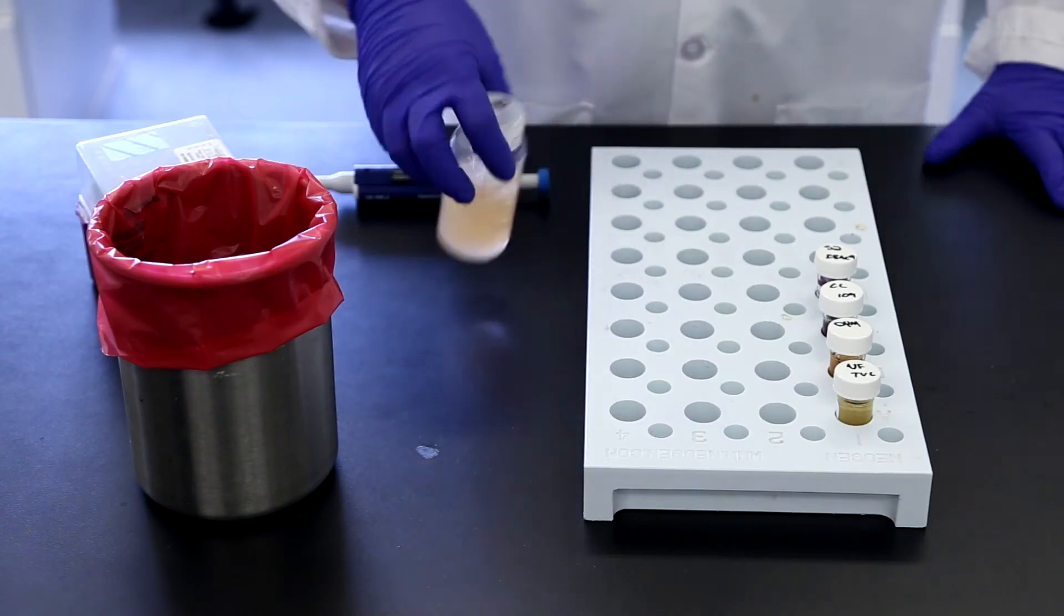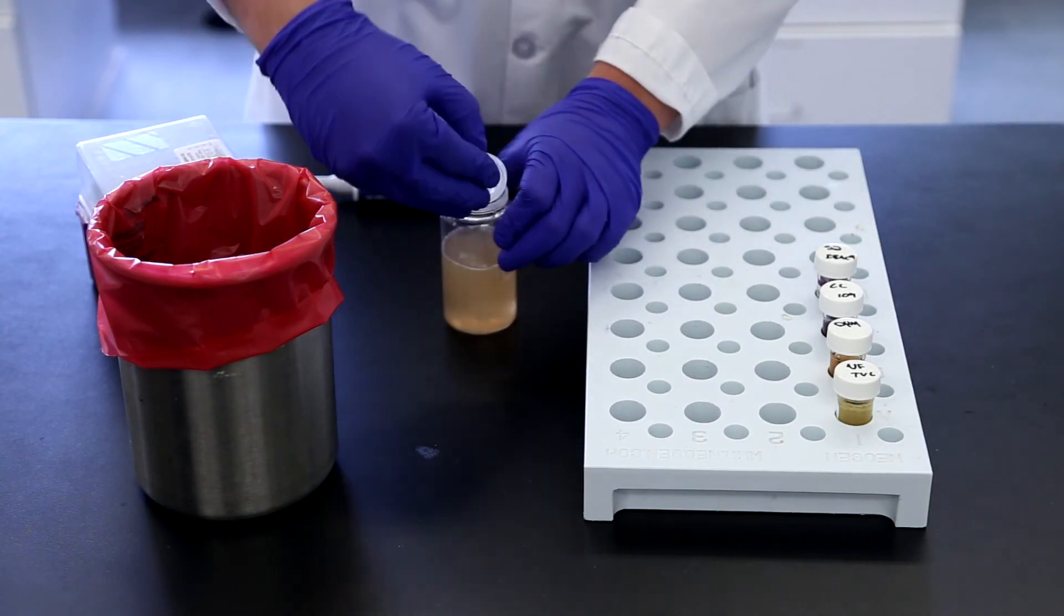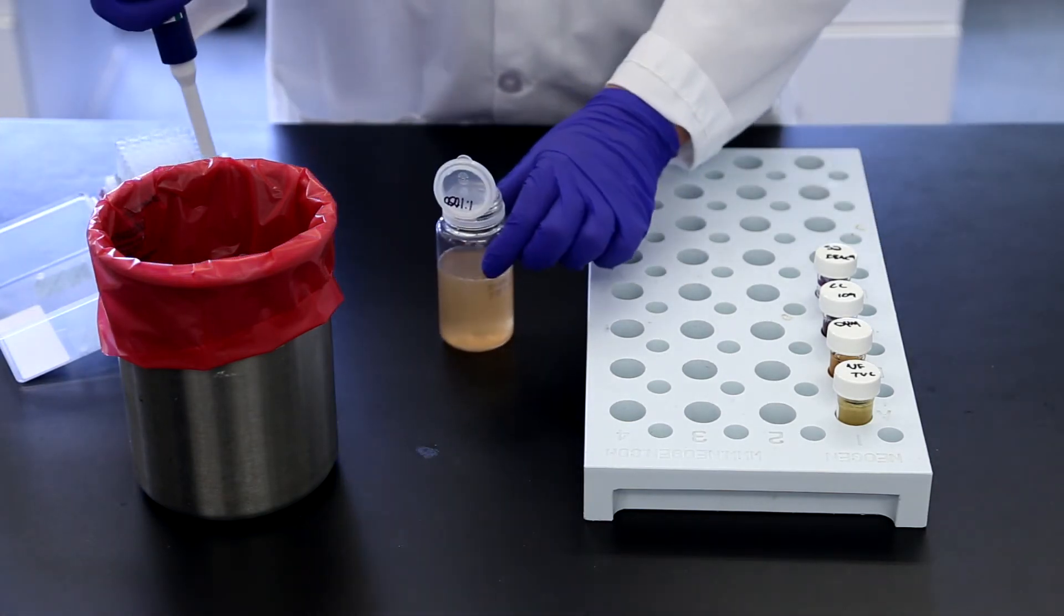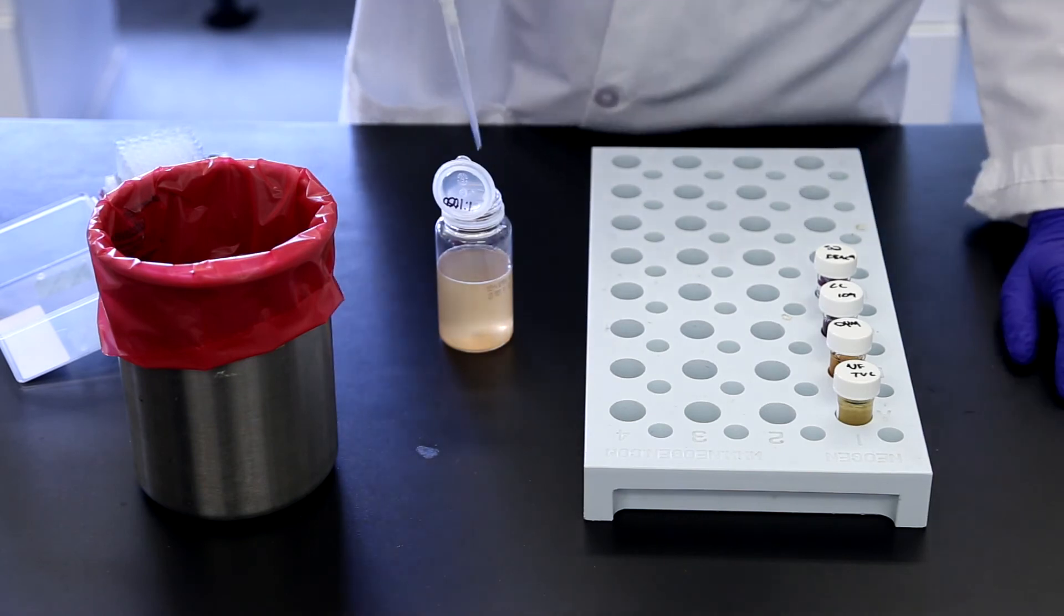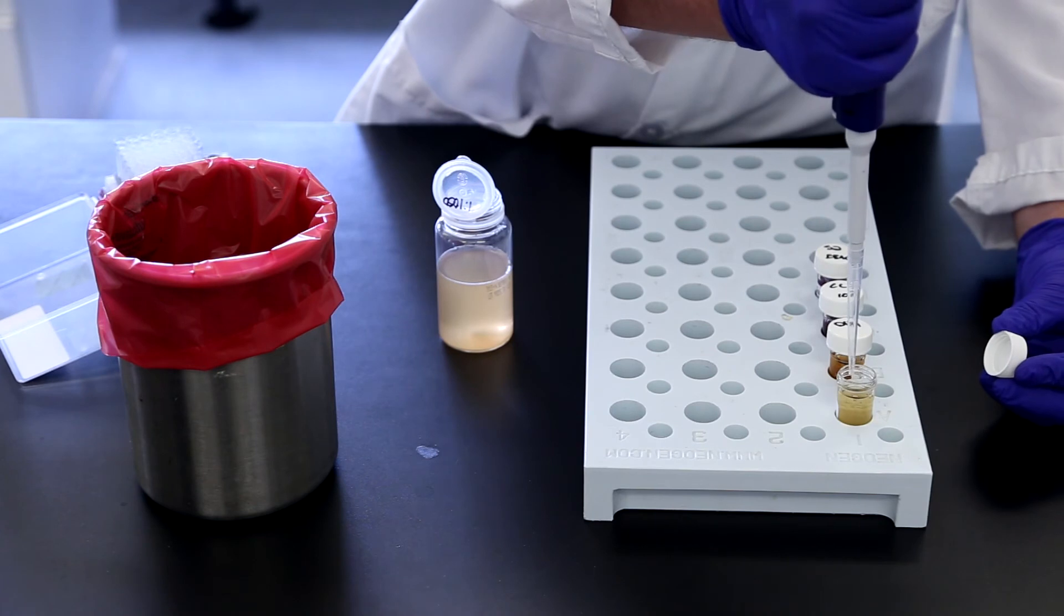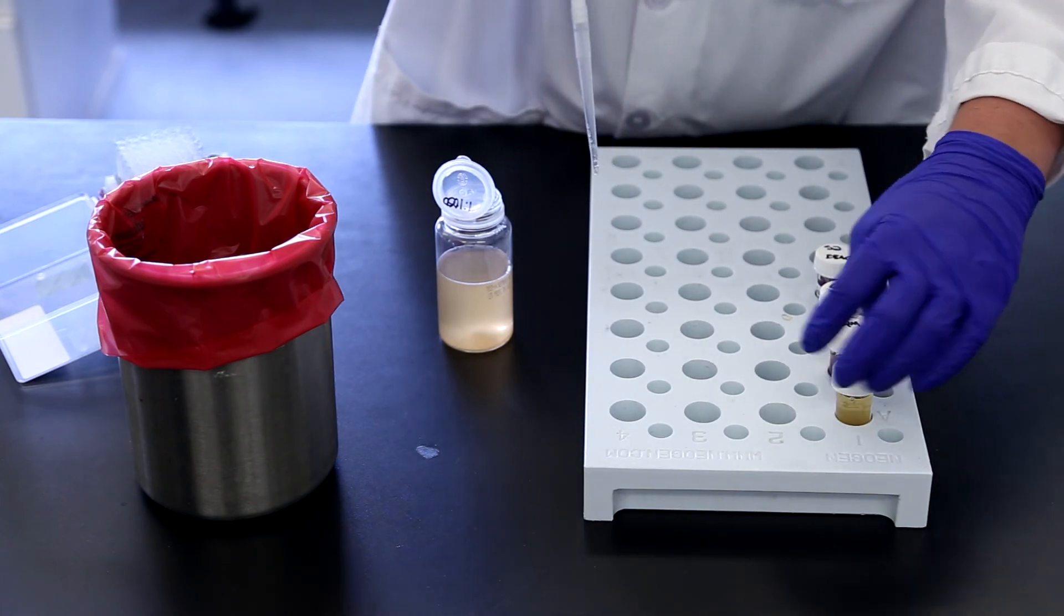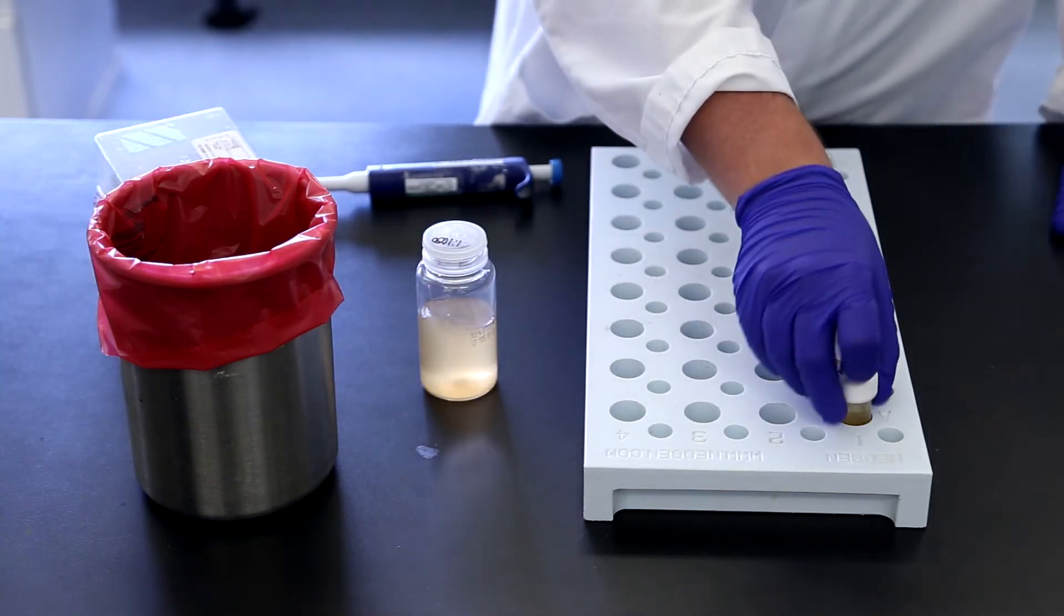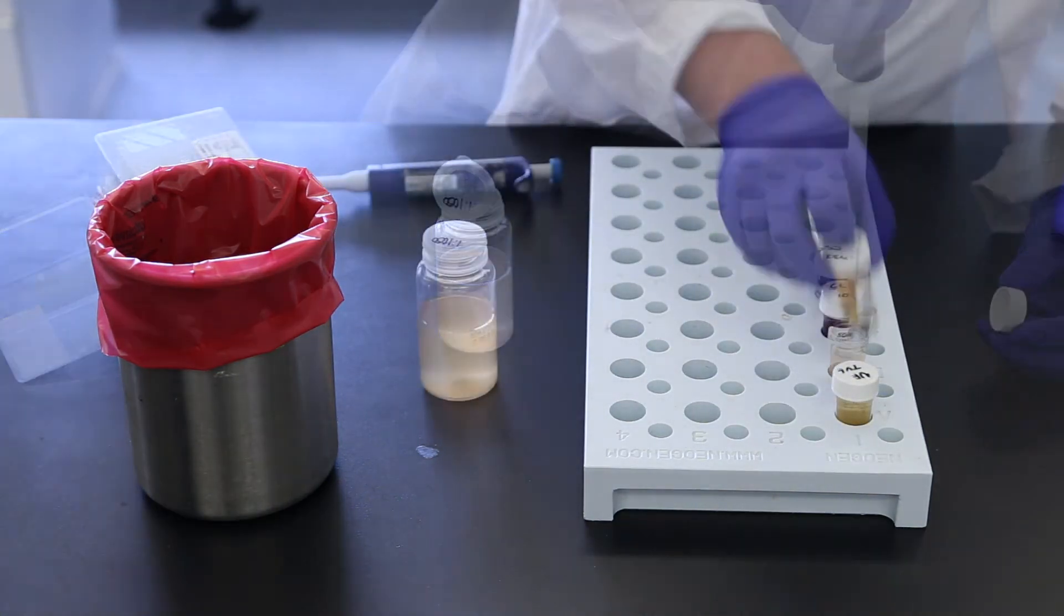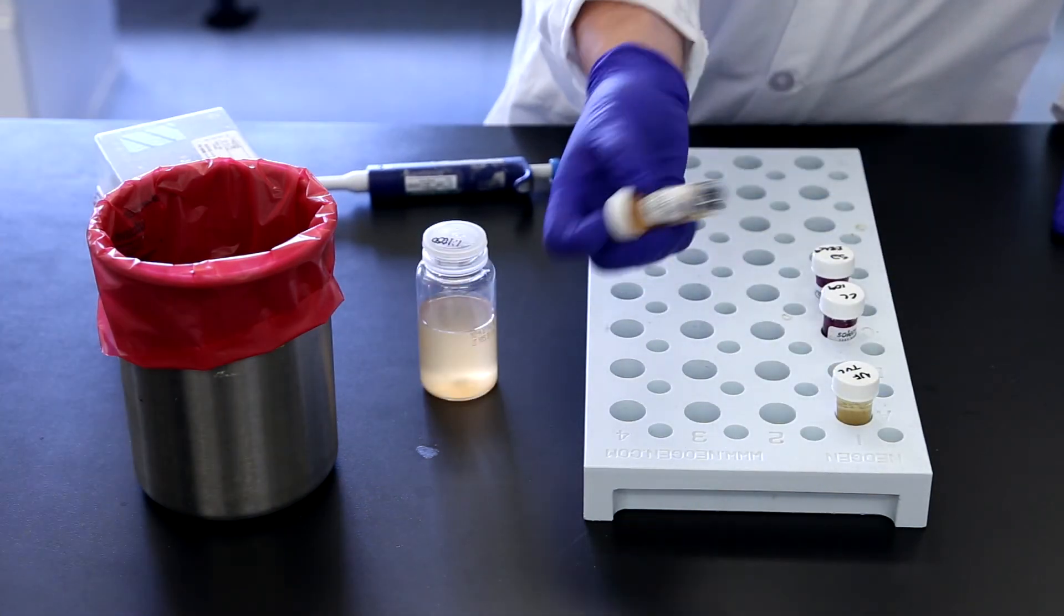Transfer the appropriate amount of sample to the vial. Secure the vial lid. Gently invert the vial three times and place in a vial rack. Repeat as needed for necessary specification vials.